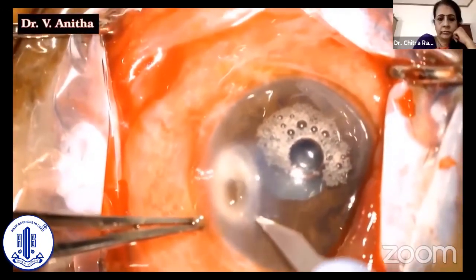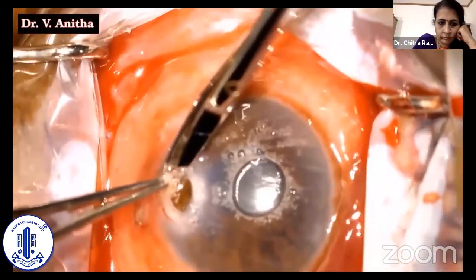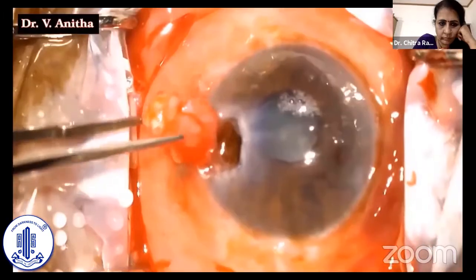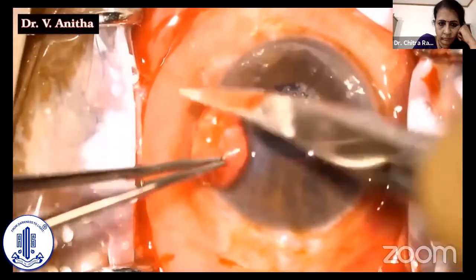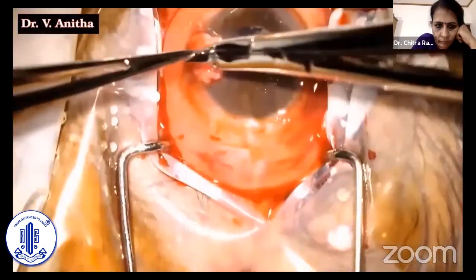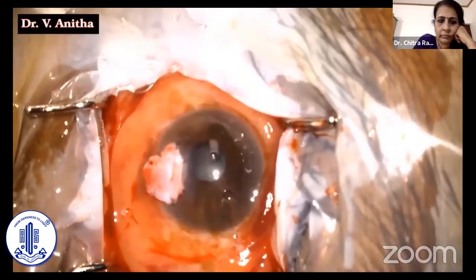The Tenon's was harvested from the superior quadrant. In our case the size was taken slightly larger than that of the perforation. The epithelium and necrotic tissue surrounding the perforation was debrided without injuring the lens and iris tissue. Even though this procedure carries a 75% success rate, there are few disadvantages: in such large perforations there is always a risk of flooding back of the iris into the site of the Tenon's, or Tenon's displacement can occur. Here, Tenon's was placed over the defect and secured well with 10-0 nylon sutures.